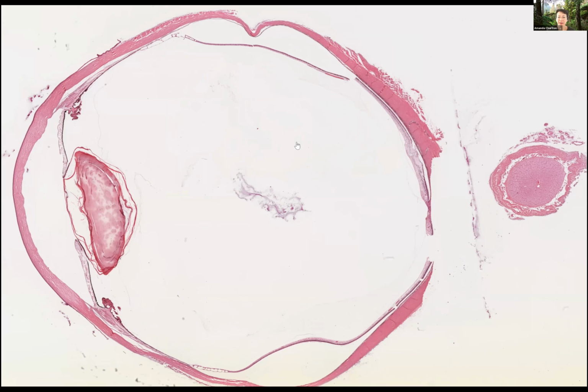Right, so what I have here is a pupil optic nerve section, pupil optic nerve head, and then optic nerve in transverse section of an enucleated globe. At low power, I don't see a tumour. So remember in Diane's slides, this is how you divide up what you're talking about globes. Is there a tumour? Is there no tumour? I don't see a tumour, so I'm going to have to start from the front.